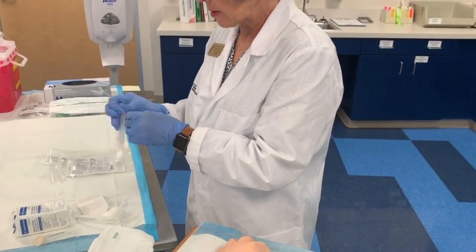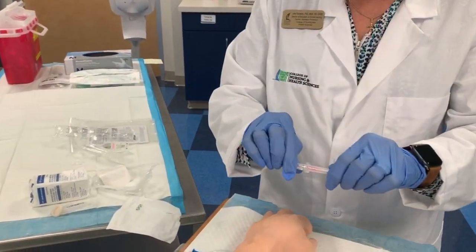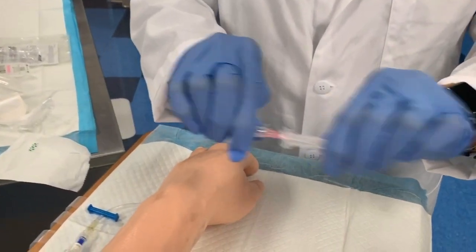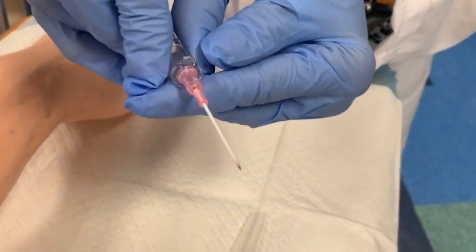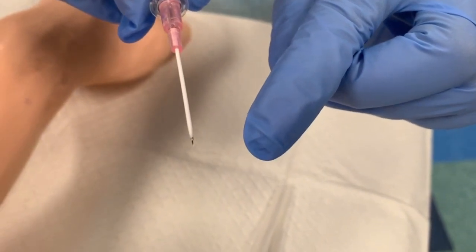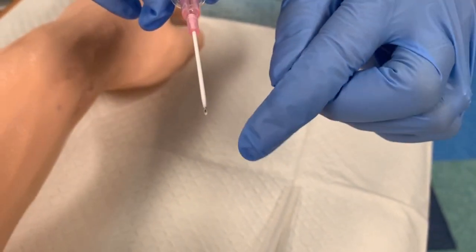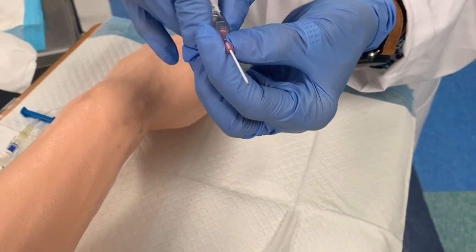Next, we're going to take our IV catheter, and you want to be sure to keep this clean and non-contaminated. So all the catheters come with a safety cap. And can you see the bevel on this needle? It's the slanted sharp spot. We always want to use our catheter with the bevel up so it helps enter the skin easier. And I always like to make sure that my slide works well.